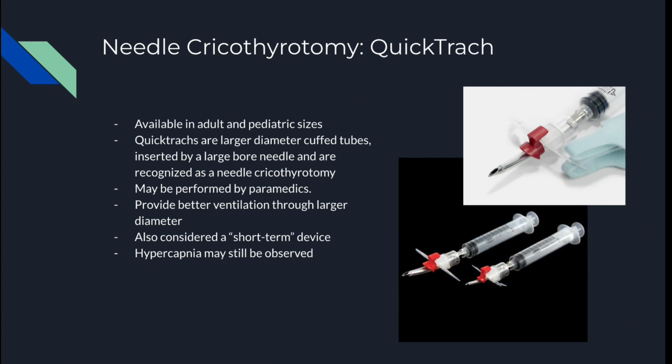Now, the benefit of this, when we're looking at these, you can see that it's a much larger diameter needle, and over top of that needle, the airway slides right in. And this airway also has inflatable cuffs, so it really does provide a good seal, and it will also provide better ventilatory effort through the airway.